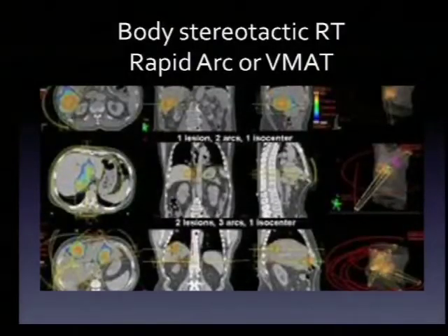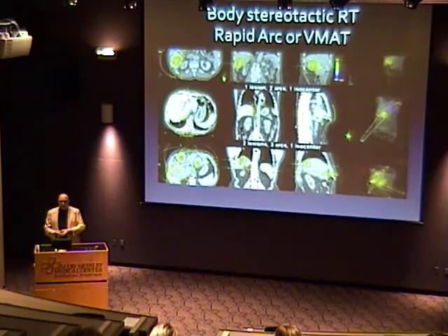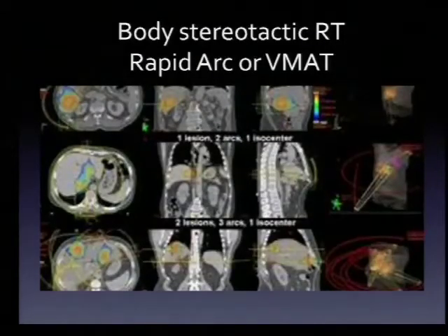There are newer techniques to deliver body stereotactic radiation. Right now we use what we call step and shoot, where the machine will rotate to an angle, shoot from that angle, and go to 5 to 10 different positions, whatever's needed to get the conformality to treat that metastasis. The new kid on the block is called RapidArc. Instead of the machine stopping and shooting at various angles, it sweeps arcs and changes the shape of the beam as it goes, so that we can achieve very elegant dose distributions, but more importantly, we can treat a whole lot faster than before. We're in the process of commissioning RapidArc therapy to bring it to this institution as well.